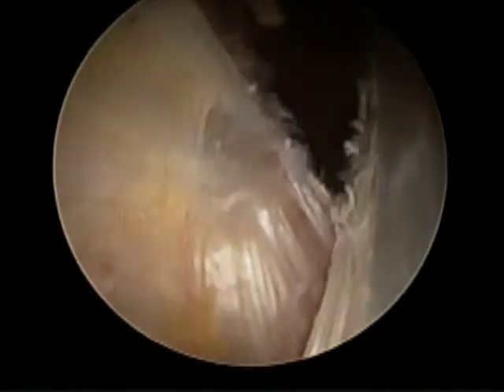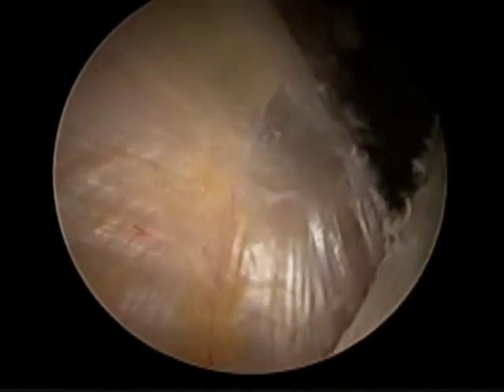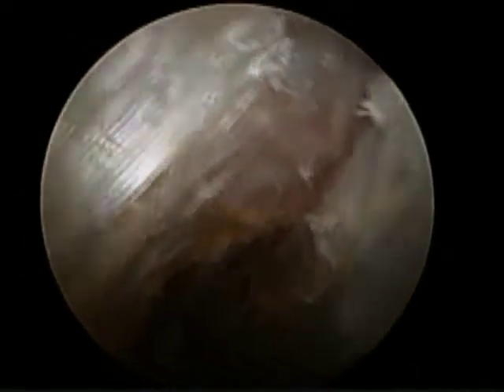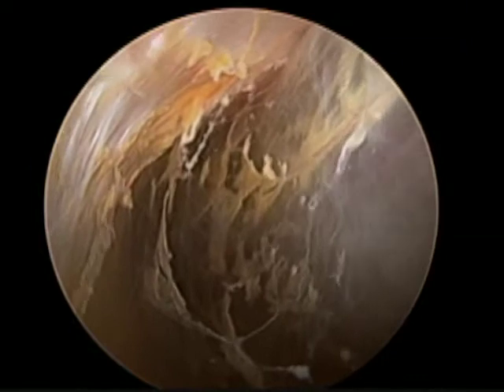On the right is the vastus lateralis fascia, and beneath us is the gluteus maximus insertion on the linea aspera. This insertion will be a part of the pathologic structure in a tight snapping IT band.